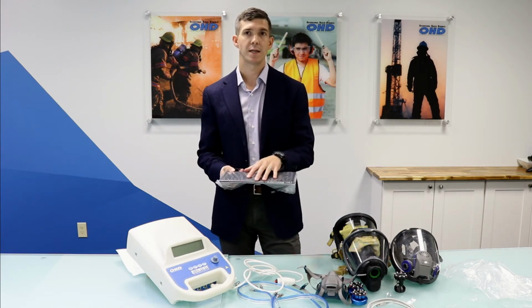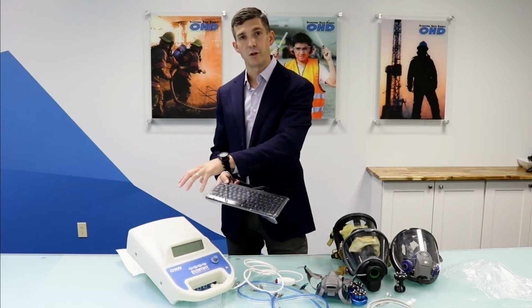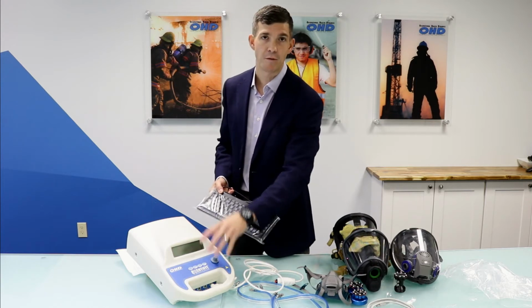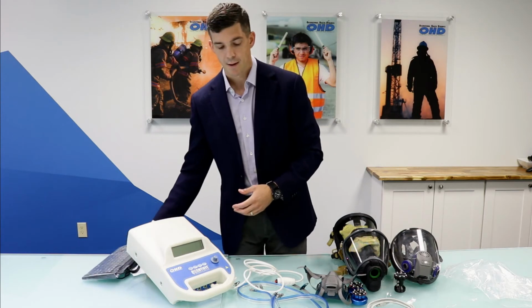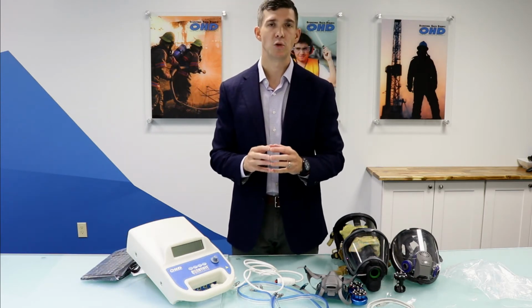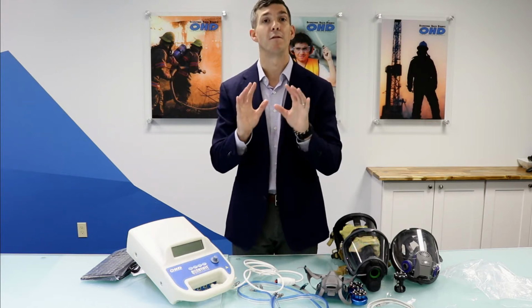So standalone testing, which we'll cover in more detail, will allow you to do testing on board of the unit. You can use your keyboard. You can also use this knob if you don't prefer to use the keyboard, but that is an accessory that comes with the instrument inside. So those are some basic components to the unit. I'll get into more adapters and connecting up to masks when we get to fit testing.